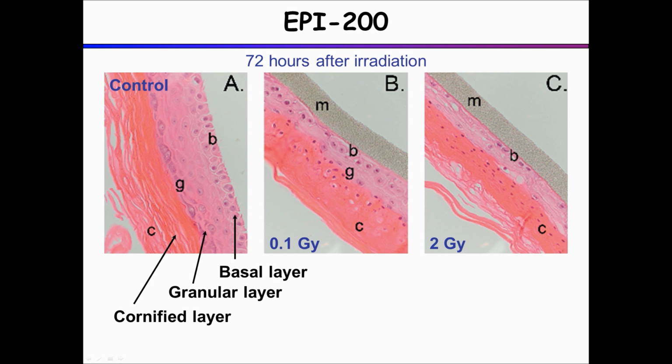After exposure to radiation, in this case this slide is just broad beam whole tissue irradiation, and 3 days later, here you can see the support membrane. And again, the basal layer, you're getting a few little hitches here. But you can also see a lot of nuclei within this granular layer here. This is after just 0.1 gray, so 10 centigray of dose to the whole tissue. So already fairly low dose. You see pretty systemic effects throughout the tissue.